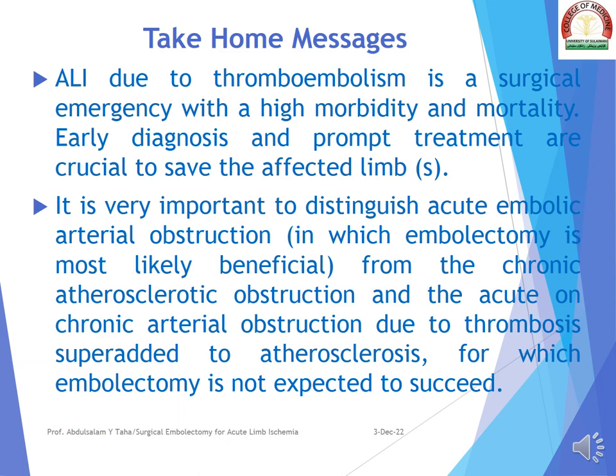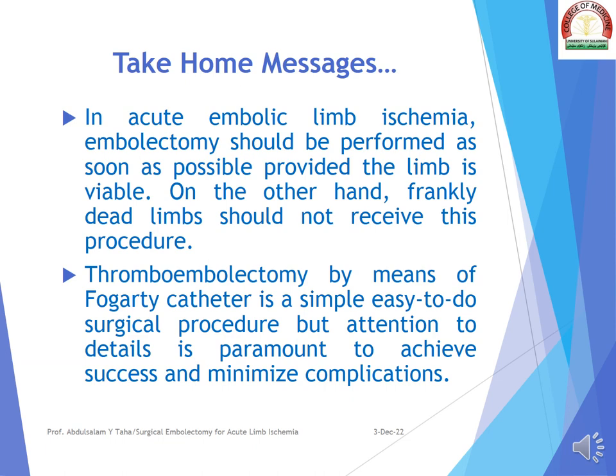In acute embolic limb ischemia, embolectomy should be performed as soon as possible, provided the limb is viable. On the other hand, frankly dead limbs should not receive this procedure. Thromboembolectomy by means of Fogarty catheter is a simple, easy to do surgical procedure, but attention to details is paramount to achieve success and minimize complications.